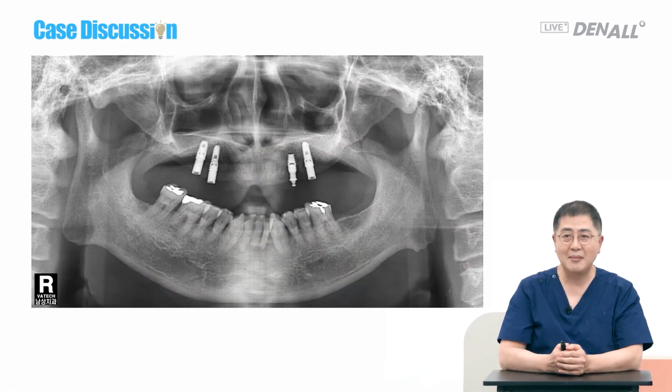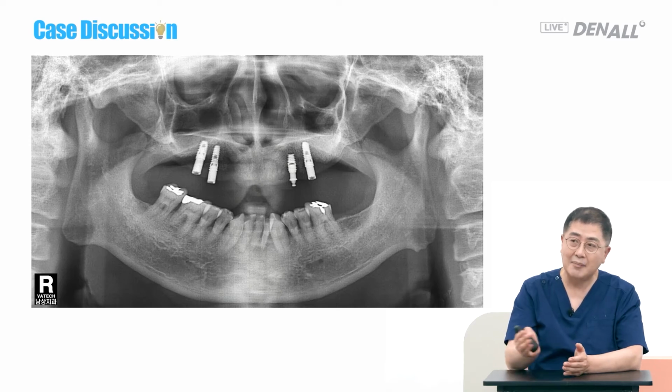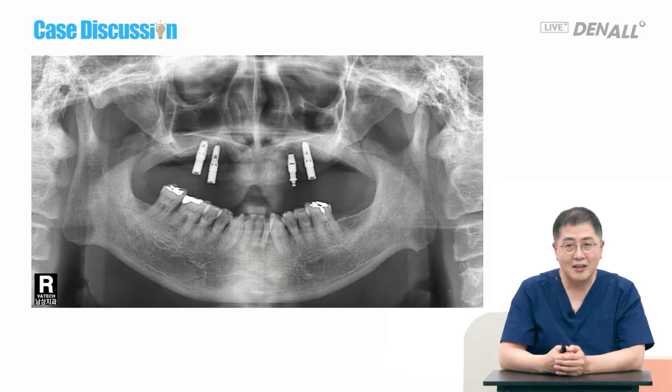I don't really hate locators. I like them in the mandible, but I was really in trouble with this patient, so I hate the locators. The problem is with the opposing teeth. Our masters showed very good long-term results when the mandible had a denture as well.